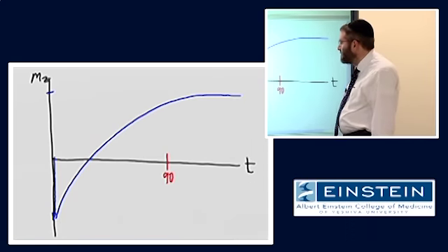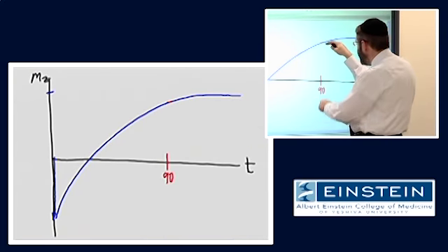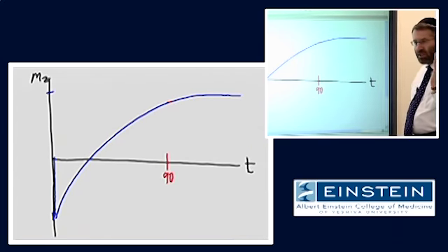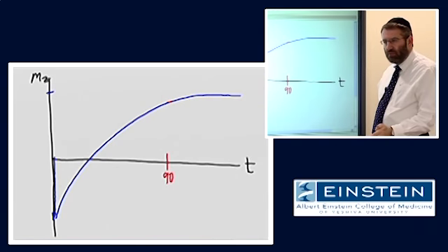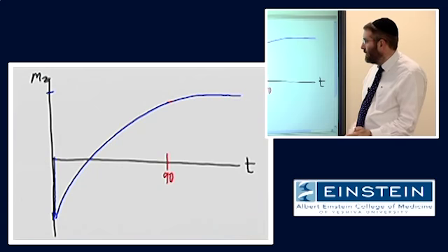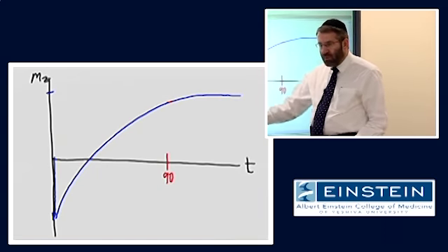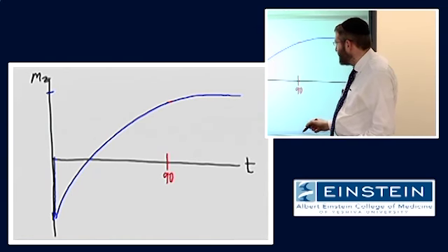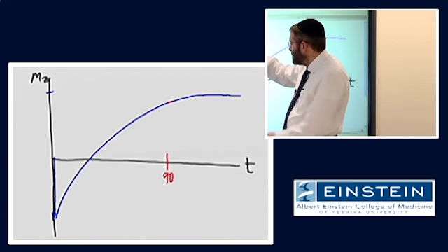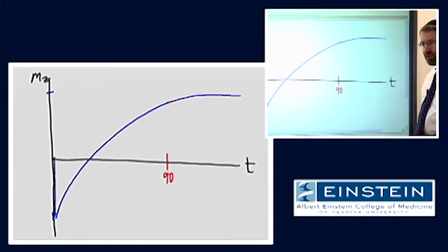What that means is that at the time that we give the 90-degree RF, we have this much longitudinal magnetization to turn into signal, to turn into transverse magnetization, which is detectable as signal. Less than if we had never done this in the first place. Remember, if we had never done this in the first place, we would have started out with a large amount, right, our fully relaxed longitudinal magnetization.